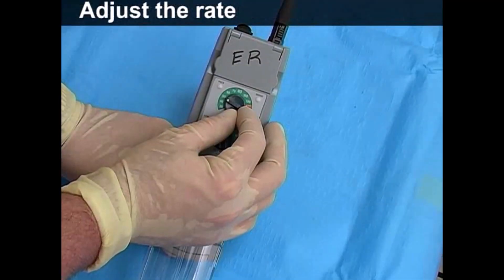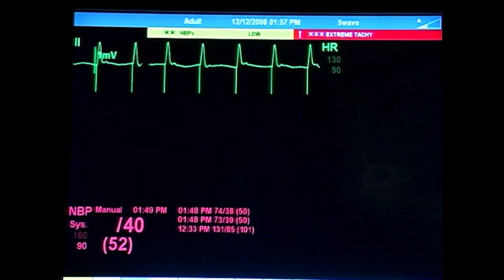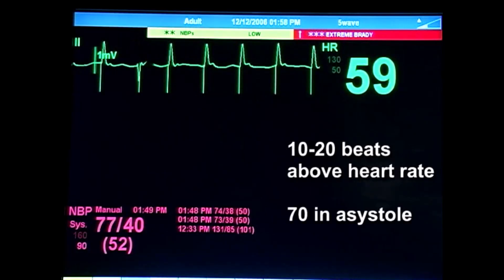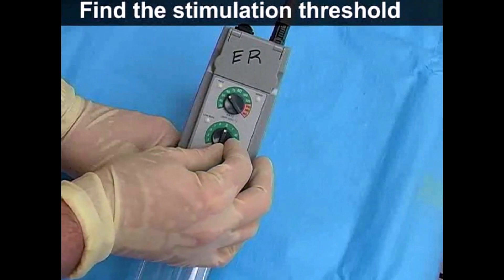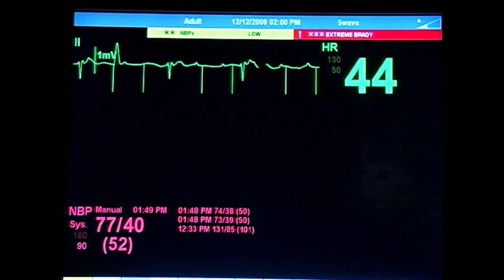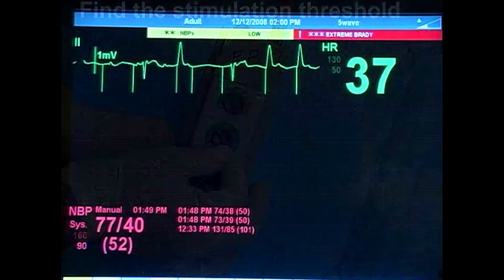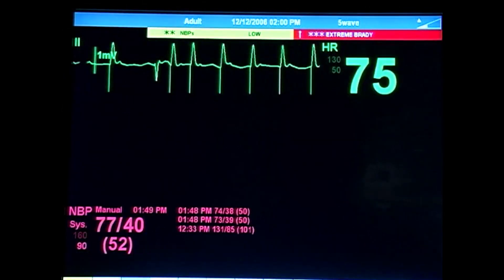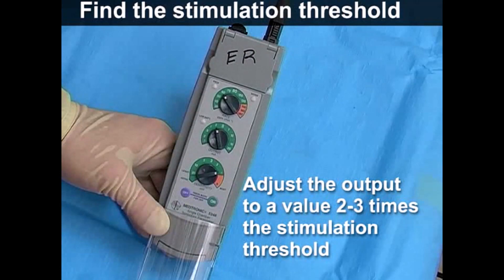Use the rate control dial to adjust the number of pacing impulses delivered per minute. This setting will vary with the clinical condition, but in general will be 10 to 20 beats above the patient's intrinsic rhythm, or at a rate of 70 in the case of asystole. Next, determine the stimulation threshold by gradually decreasing the energy output until capture is lost. Ideally, this will occur at 1 milliamp or less. Then, slowly increase the output until capture is regained. The value at which capture occurs is the stimulation threshold. Adjust the output dial to a value 2 to 3 times the threshold in order to maintain a margin of safety.